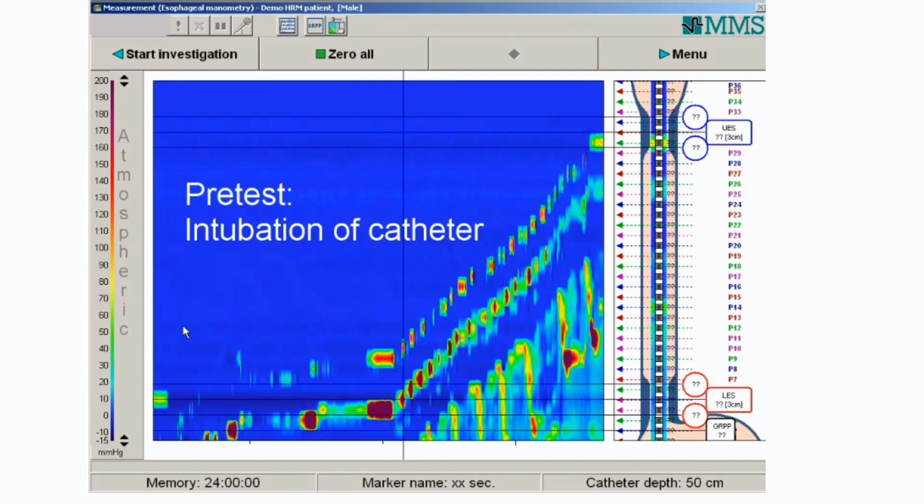This is very, very rare. It happens only if the catheters fall down on the ground or from strong kinking. But in this case, we have another question. If I did the calibration and found one sensor not working, shall I stop the procedure or can I continue? Actually, it depends on the position of this sensor.